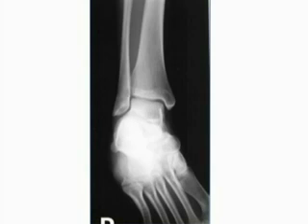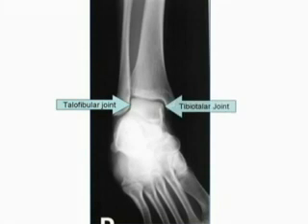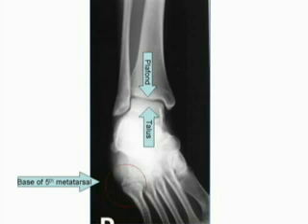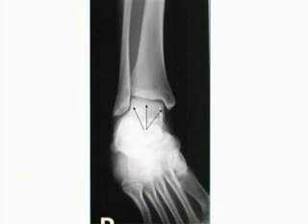The AP medial oblique or mortise view ankle should demonstrate the talofibular joint, the tibiotalar joint, plafond, and talus. The base of the fifth metatarsal is also demonstrated. The appropriate contrast and density will demonstrate both soft tissue and trabecular of the bone.